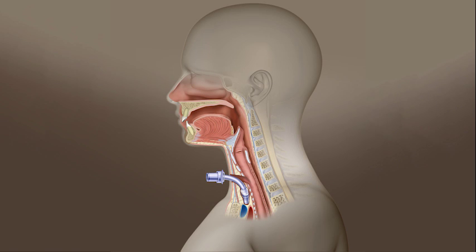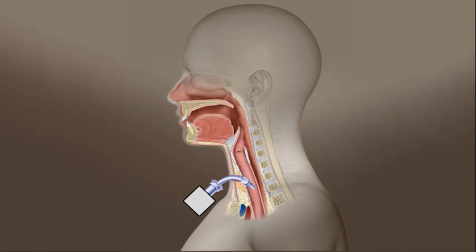Assess the patient to determine if they are moving air through their native upper airway. First, assess patient color and work of breathing, followed by oxygen saturation. If the patient is not adequately breathing through their native airway, it will be necessary to assist them. This should be accomplished by the two following methods. Hold a sterile 4x4 gauze or other object over the stoma while you ventilate over the nose and mouth with a resuscitator mask and bag. It may be necessary to have an assistant available, as this can be difficult to coordinate by oneself.